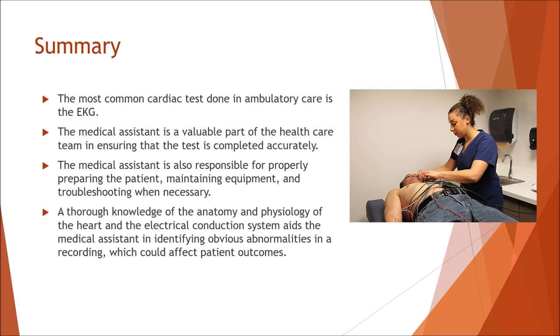So we talked about the EKG. I didn't go too much into detail. I kind of just wanted to discuss what was in the book. Make sure you know the QRS complex. Make sure you know your 1500, 300, and 6-second rule. Make sure you know the different types of artifacts and how to fix them. And just kind of the basics of making sure you get two identifiers, introduce yourself, make sure the patient feels comfortable. If you get this down, I'm pretty sure you're going to do pretty well on the test.